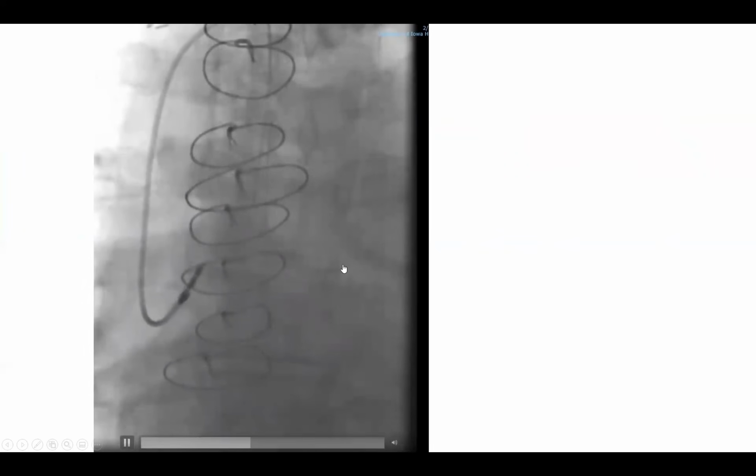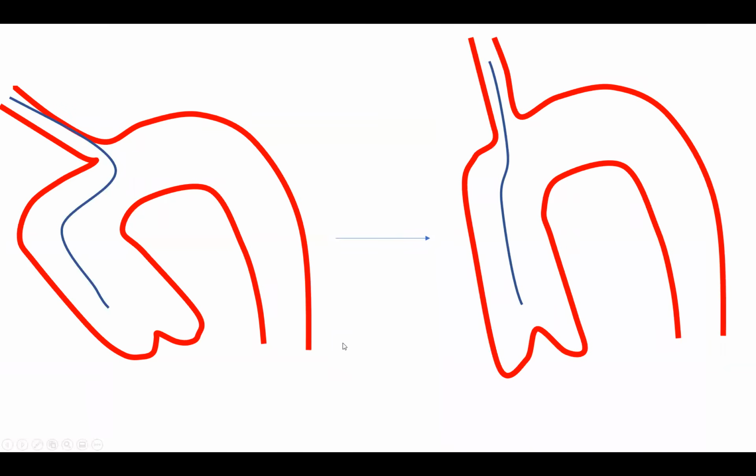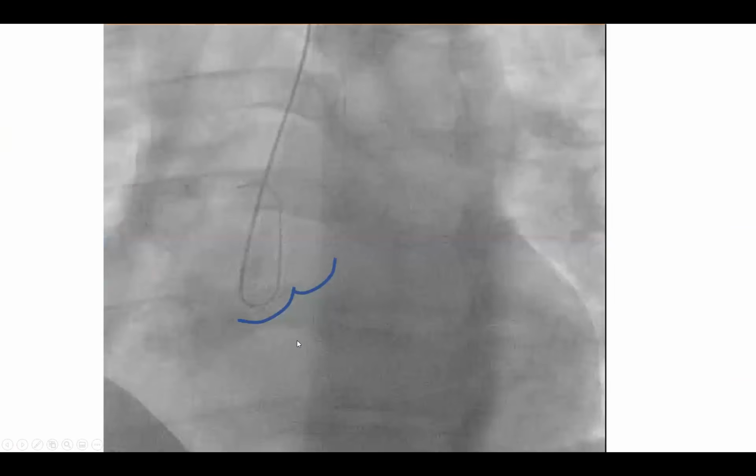That's why I said your assistant is loosely holding the wire and ready to readvance it as needed. And sometimes, as I said, pull it slightly as you're advancing across that band. Pulling it slightly will suck your catheter in. So you need to have some versatility in your action on that wire. But your hands are on the catheter and somebody is assisting you with that wire.